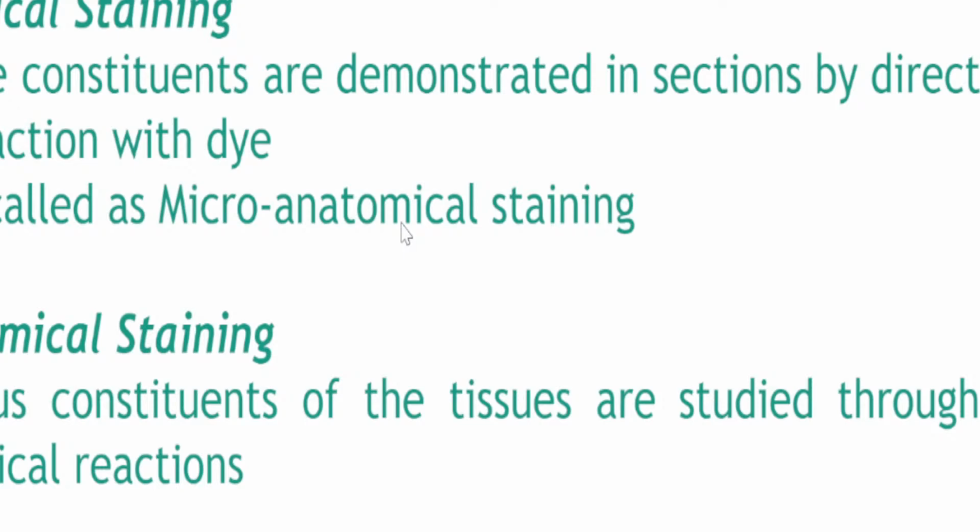Now, what's different in immunohistochemistry is that it not only relies on bright field or light microscopy, but you can also use fluorescence antibody microscopy. What's that? When you flash an excitation lamp on your tissue, if an antibody reacted to the cell or tissue in question, it will fluoresce and create a staining pattern or fluorescence pattern. So that's the difference between them.